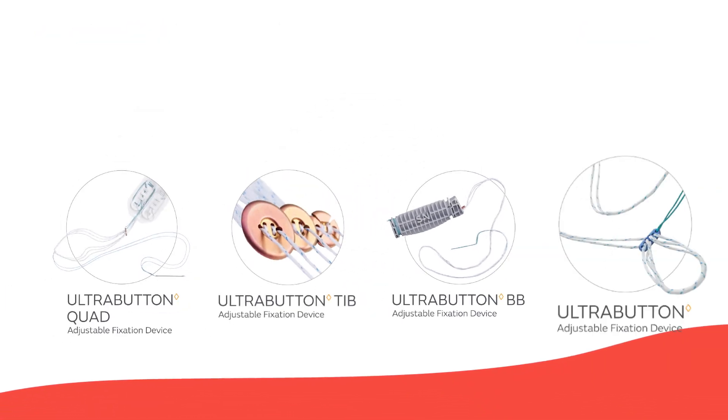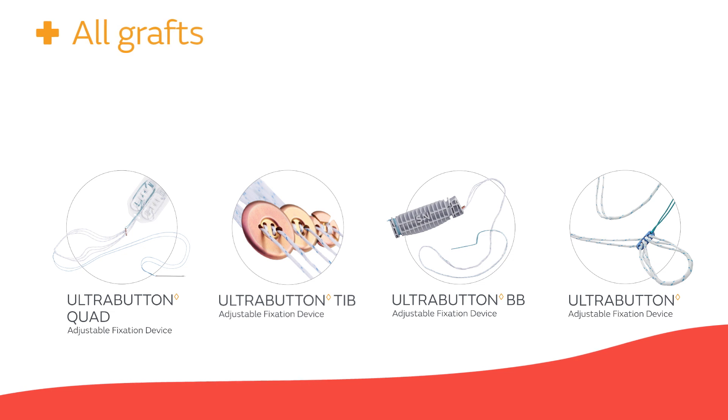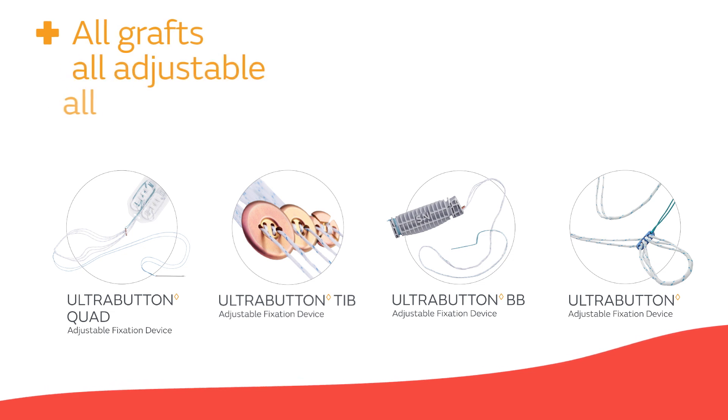The Ultra Button adjustable fixation family — all grafts, all adjustable, all secure.